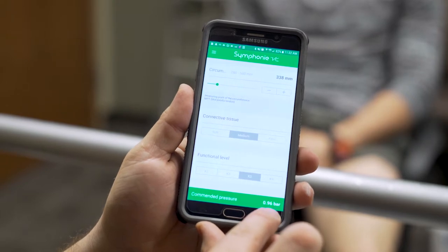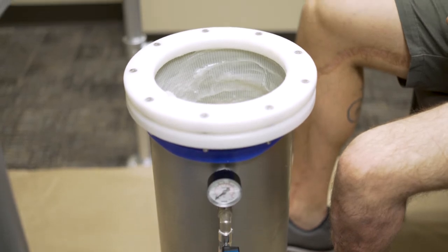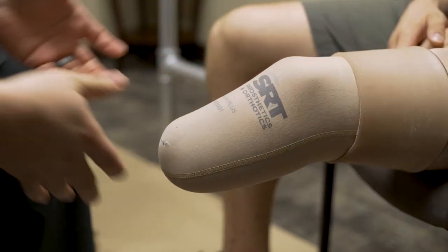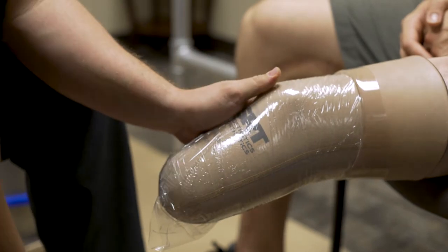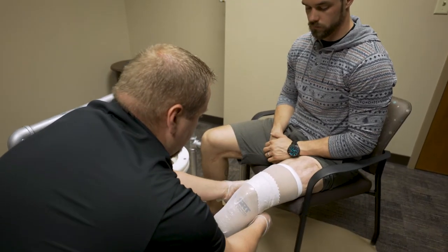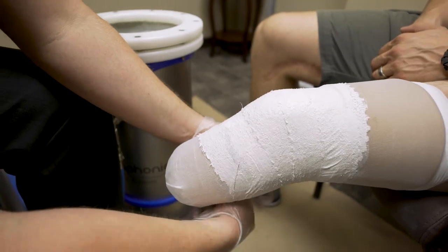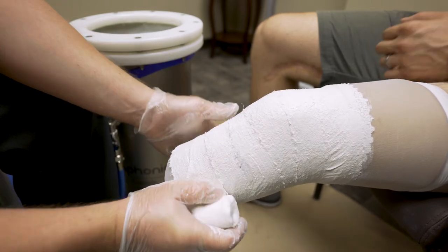By achieving this pressure during the casting system, this will reduce the need for further modifications of the cast. We are now ready to cast the limb. Use the patient's liner they will utilize with the prosthetic, saran wrap or some sort of barrier, and a moist stockinette. Apply these to the limb, then apply plaster bandage material evenly, making sure areas are not too thick and there are no holes. Do not compress the limb by manipulating the plaster bandage material.